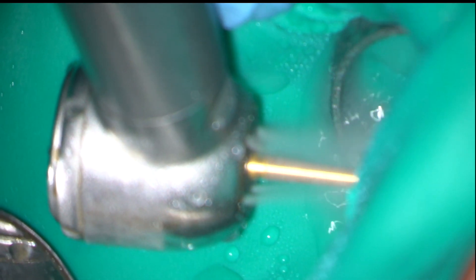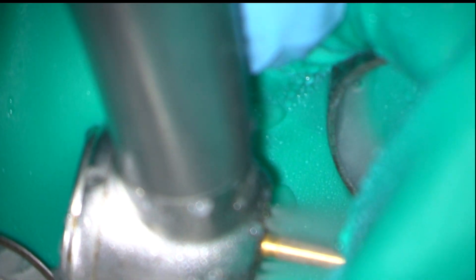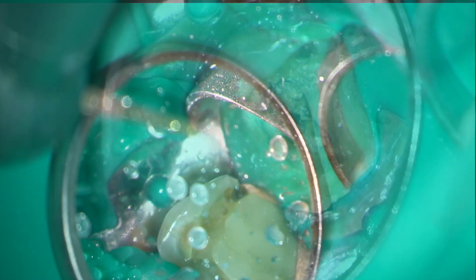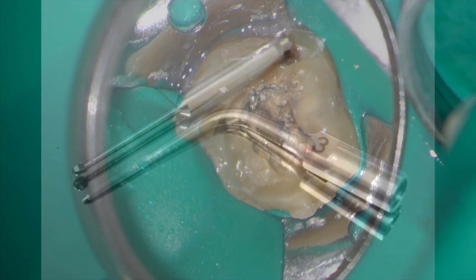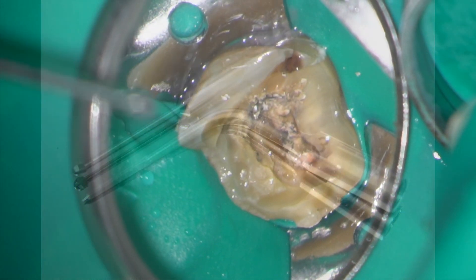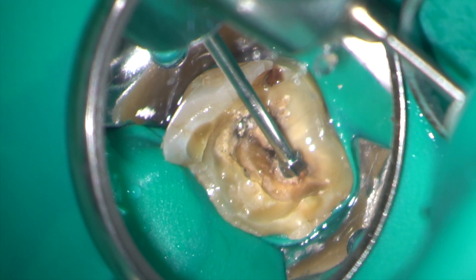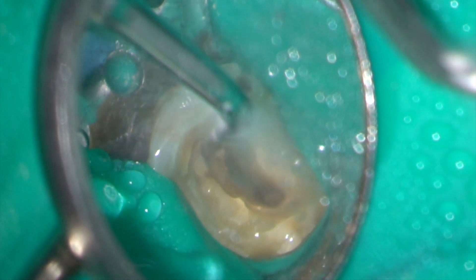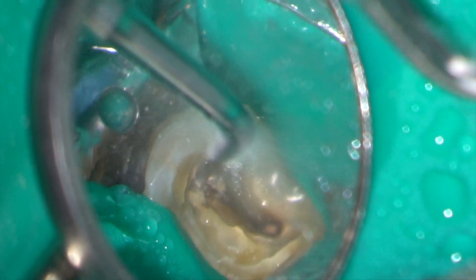After rubber dam isolation, the composite restoration was removed with a long tapered diamond burr. I'm going to use a large LN burr and a StarTex 3 ultrasonic tip to refine the access. Here I'm using the StarTex 3 tip to clear away debris and cement from around the head of the silver point.